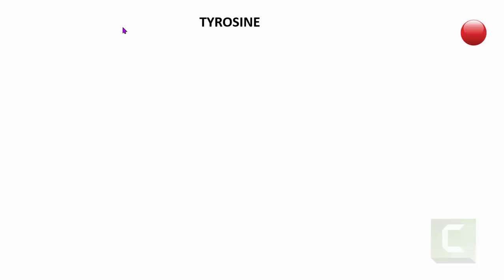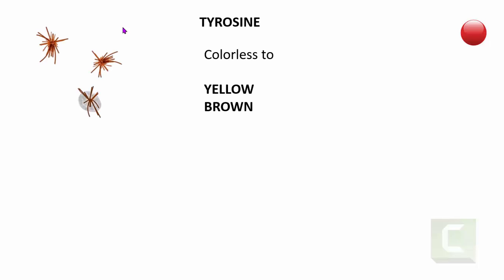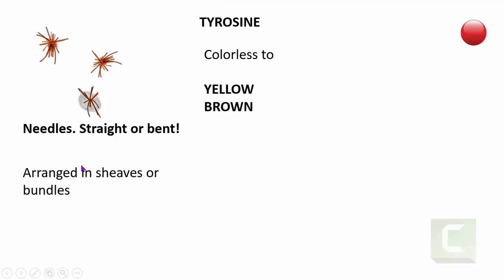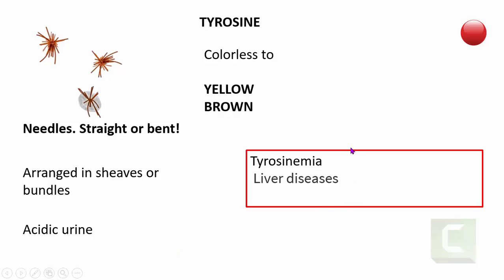The next amino acid crystal is the tyrosine crystal, which is colorless or most often yellow-brown in color. These are needle-shaped crystals — either straight or bent — and are almost always arranged in sheaves or bundles. They are found in acidic urine. Tyrosine crystals are seen in tyrosinemia, an inborn error of metabolism where the body cannot metabolize tyrosine, leading to its accumulation and excretion in urine. They are also found in various liver diseases.